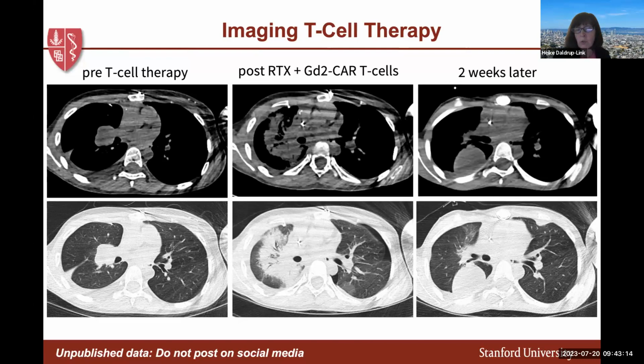Are there microscopic areas of tumor metastases? Are these areas of inflammation? But either way, it's important to recognize that these are transient cell infiltrates apparently that we see after infusion of CAR T cells. They should not be mistaken for an infection such as COVID or other atypical infections. They are transient findings that we see after this therapy. This patient, by the way, also had a pneumothorax developed here after the therapy, which then resolved, and another tumor nodule, unfortunately, that progressed later.